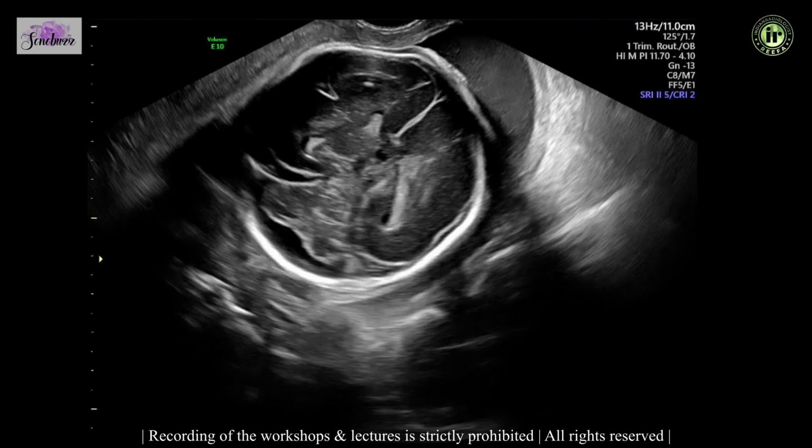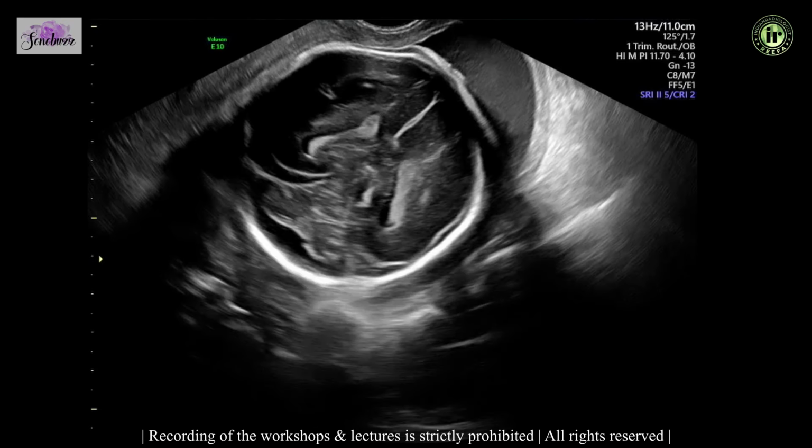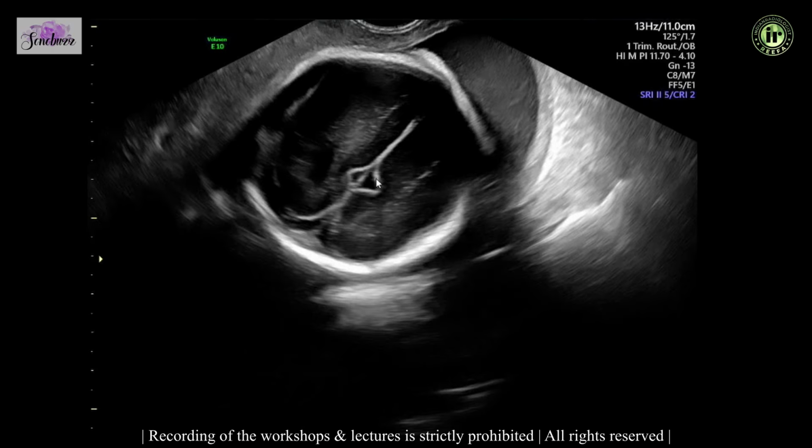So we are first doing a coronal scan, and we take about 4 sections from posteriorly. You can see that is the cerebellum here. This is the occipital horns of the lateral ventricle. This is the parieto-occipital sulcus. And that is the calcarine fissure here, and that's the calcarine fissure.